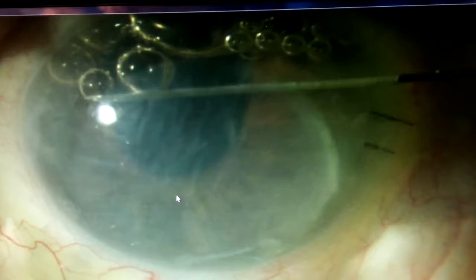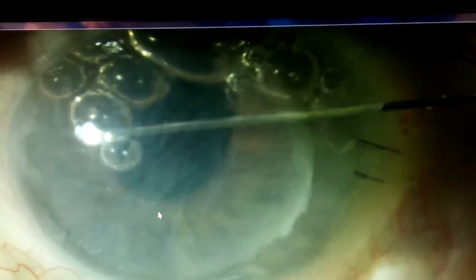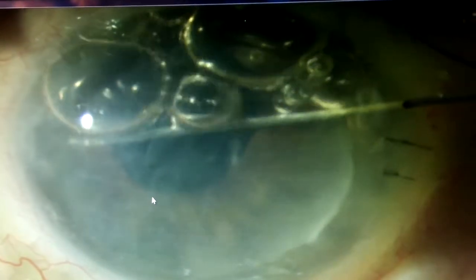Here I'm demonstrating how to refloat the graft at the slit lamp. Again, like the rest of the slit lamp procedures, betadine prep and tetracaine and lidocaine drops are a must.